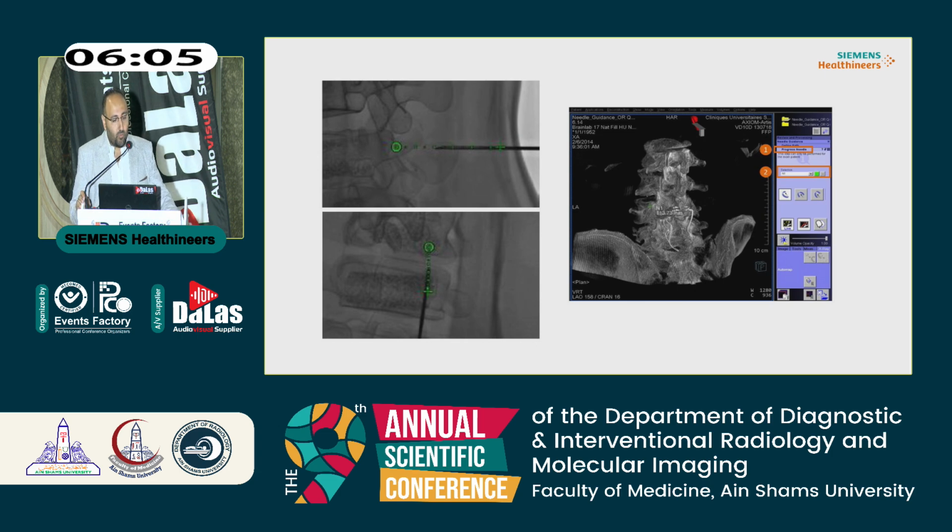And of course, after we reach our target, we can take another CT or DynaCT to ensure that our needle is in position. Another question: how many needles can we do with this software? The answer is unlimited needles. We can do unlimited needles by using needle guidance.